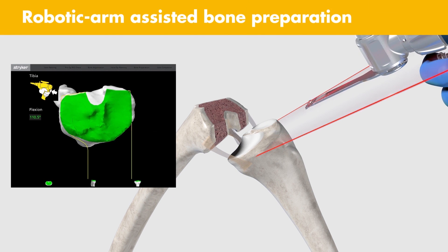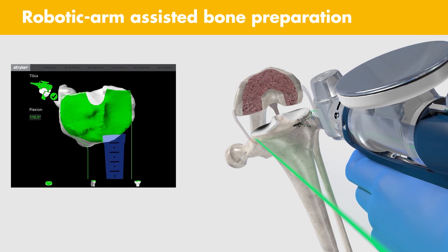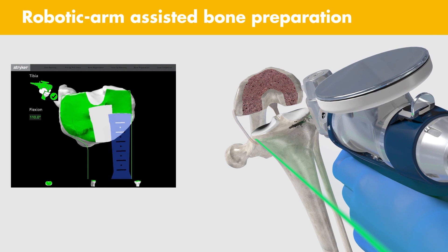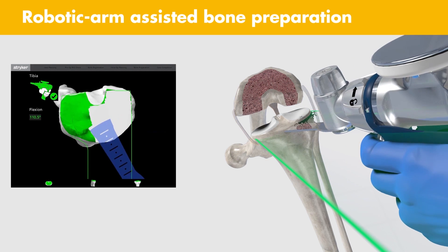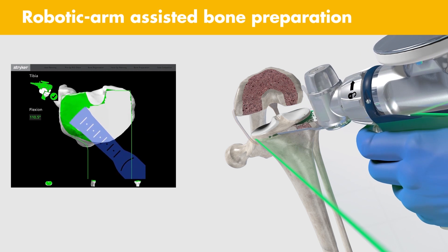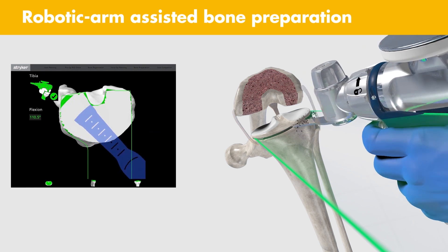Robotic arm assisted bone prep: The MAKO Total Knee application does not require alignment instruments or cutting guides. Similar to MAKO Partial Knee, virtual boundaries assist the surgeon in executing bone resections to the final plan. These virtual boundaries have the potential to protect essential anatomical structures of the knee during bone preparation, including the PCL and the popliteal artery.